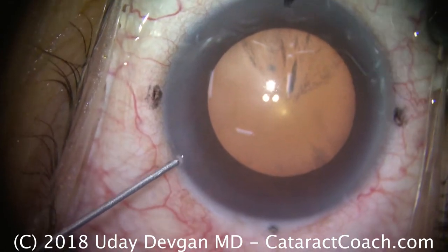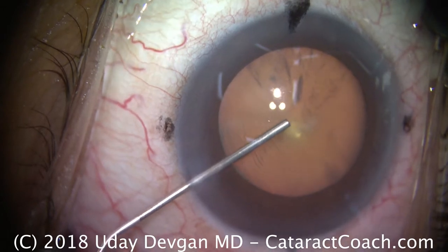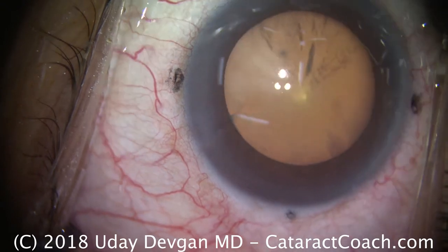We'll put some viscoelastic in here. Notice how we want the wave of viscoelastic coming across the eye. That wave of the dispersed viscoelastic really will coat the endothelium of the cornea and provide better protection.